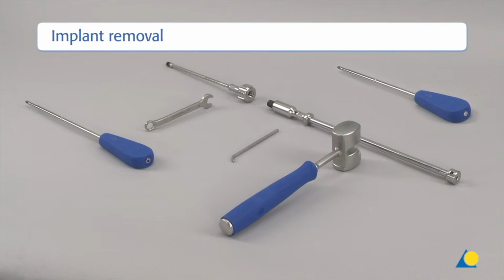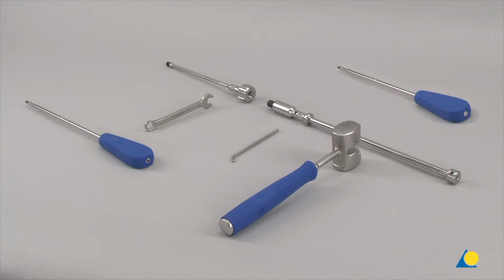Clinically, implant removal is an optional procedure. The instruments needed include the screwdriver, star drive T40 with spherical head, cannulated, length 330 mm. The extraction screw for tibial and femoral nails, the combination wrench, 11 mm diameter, the hammer guide, the pin wrench, 4.5 mm diameter, the screwdriver, star drive T25, self-holding, length 330 mm, and the combined hammer.